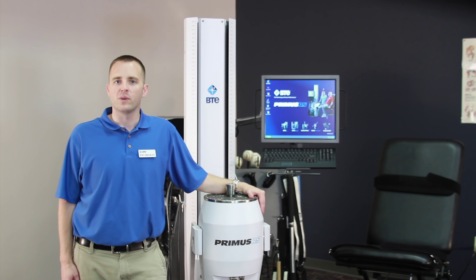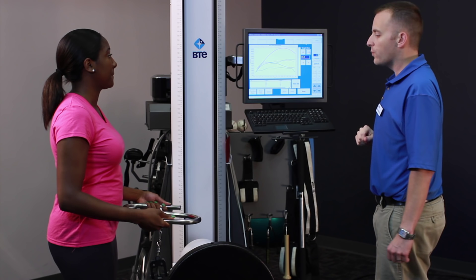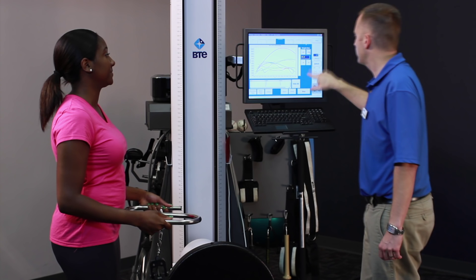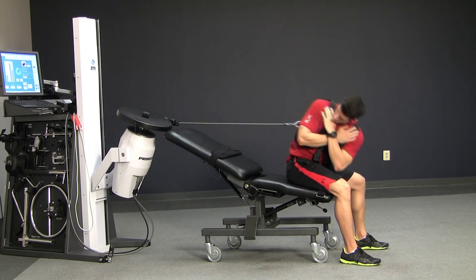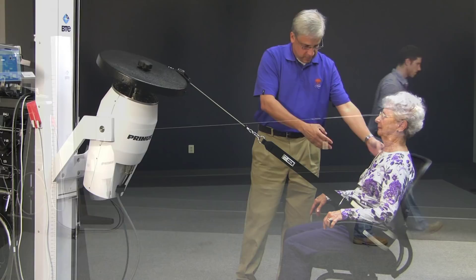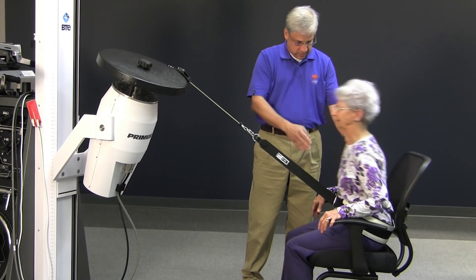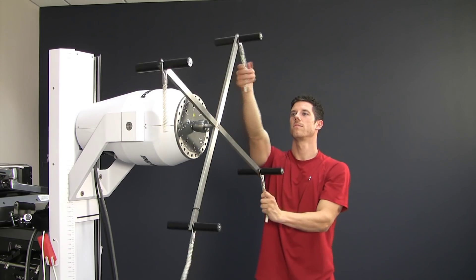When doing physical rehab, we always want to go from isolation to integration. This means you want to isolate individual muscle groups first, then progress to doing combination tasks integrating multiple muscle groups. Primus allows you to replicate all of these motions, including lifting, twisting, and pushing a load. With its wide range of attachments for duplicating real-world functions, Primus gives you the ability to treat almost any patient who walks in your door. It simulates life's activities to achieve functional outcomes that return your patients to their daily routines.